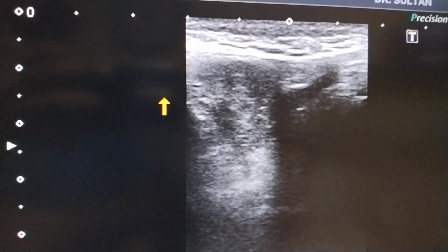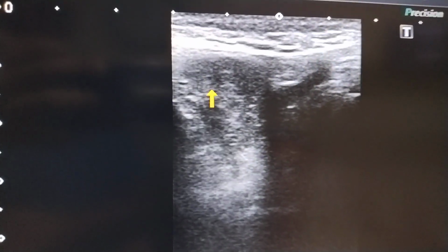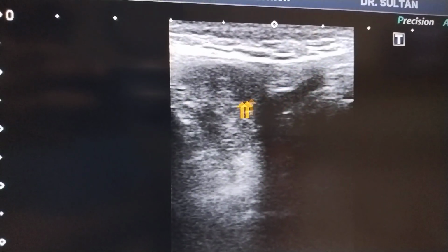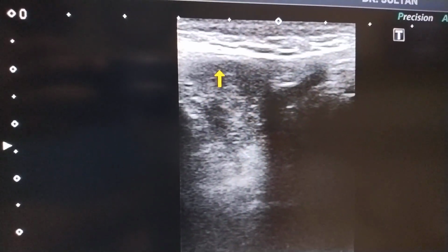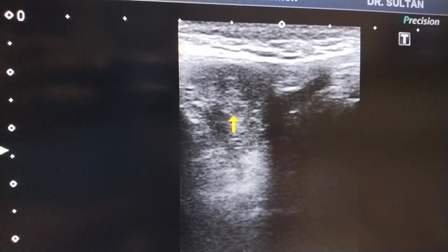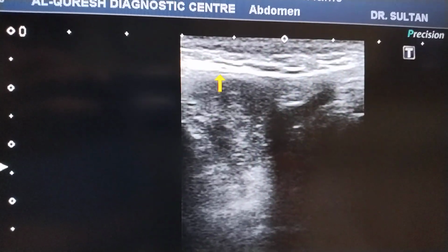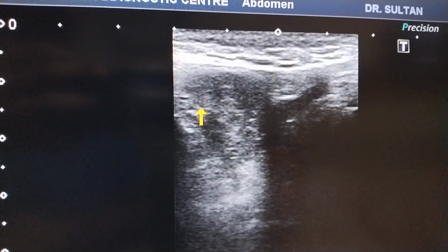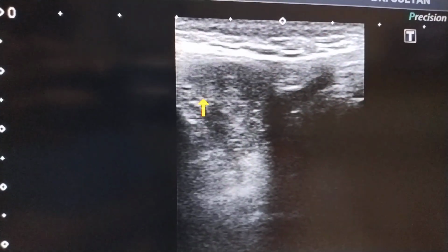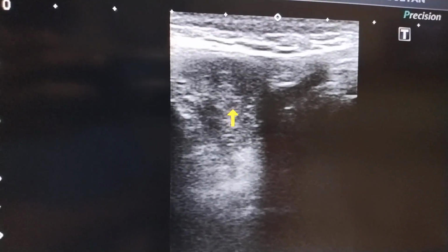In the indirect, the herniated segment travels in the inguinal canal toward the superficial inguinal ring. Here these contents move upward through the posterior wall and to the abdominal wall anteriorly. So this is not the indirect inguinal hernia, this is the direct inguinal hernia on the right side.